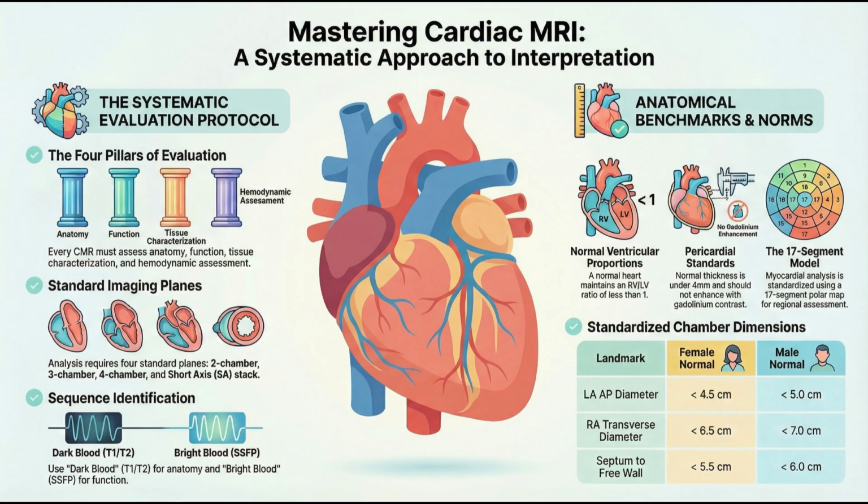The paper throws a lot of acronyms around here. TrueFisp, Fiesta, Balanced FFE. It sounds a bit like a branding war. It is exactly a branding war. It's Siemens, GE, Philips. But the generic term, and the one you should really remember, is SSFP, steady state free precession. And why is SSFP the workhorse for these cardiac movies?